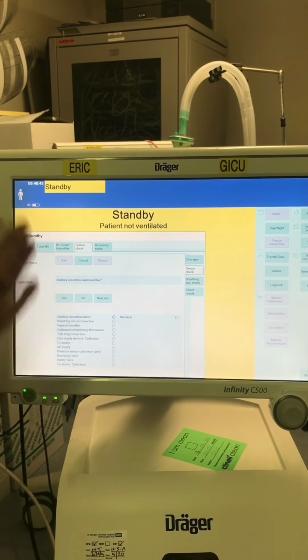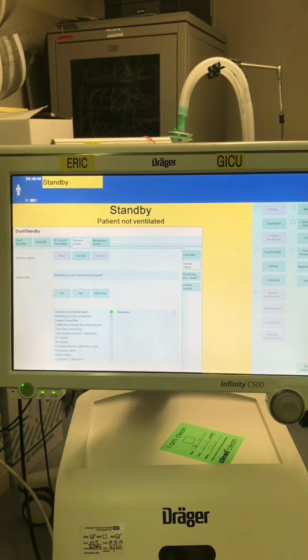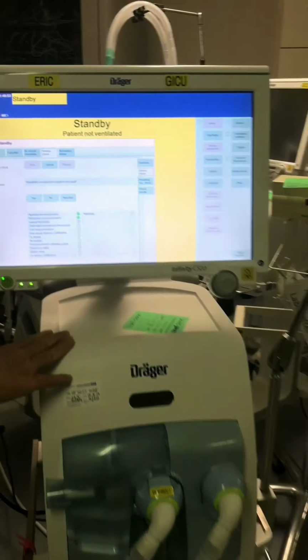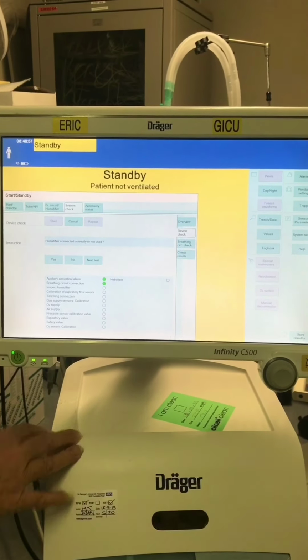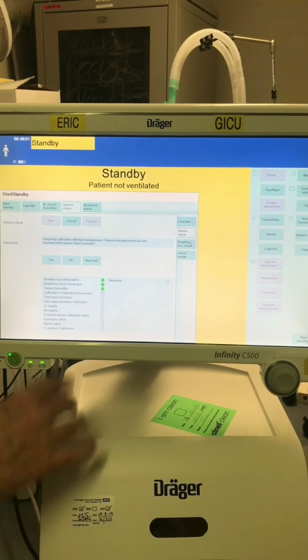First one is, can you hear the alarm? Yes. Second one is my breathing circuit. Is it correctly connected? Yes. Do I have a humidifier? We don't have a humidifier, we're using HMEs, but if it's not used, I say yes. And now it's preparing for calibration.